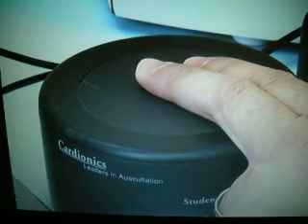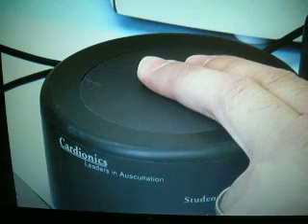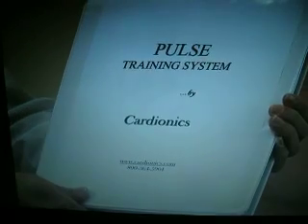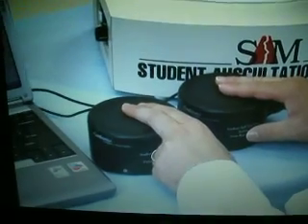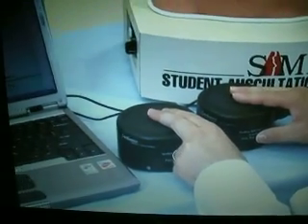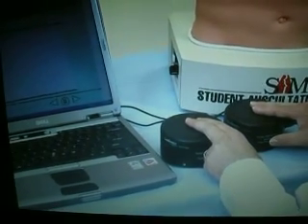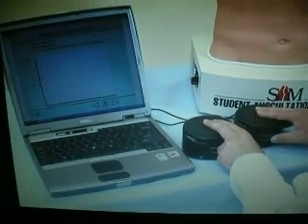The ability to palpate a pulse properly requires both knowledge and manual skill. The Pulse training system teaches both. A very complete text workbook is part of the system. This system provides bimanual tactile pulses. Pulses are palpated at the radial, brachial, femoral, posterior tibial, and dorsalis pedis areas.